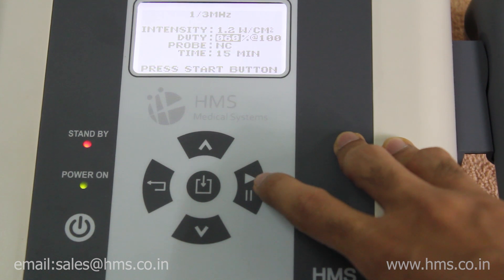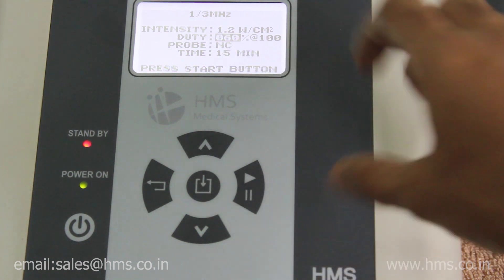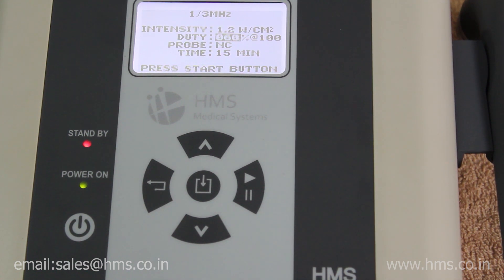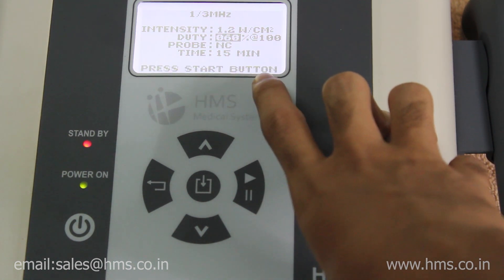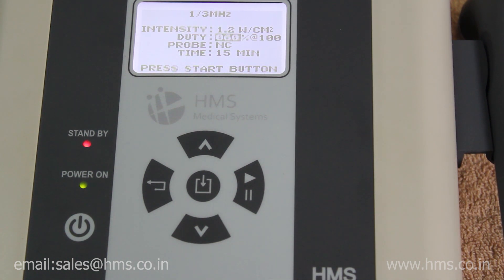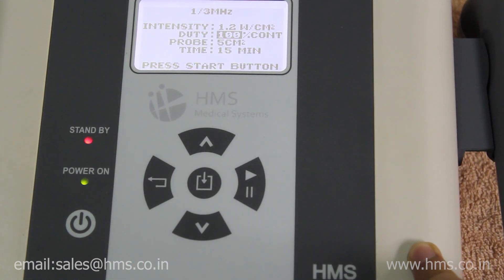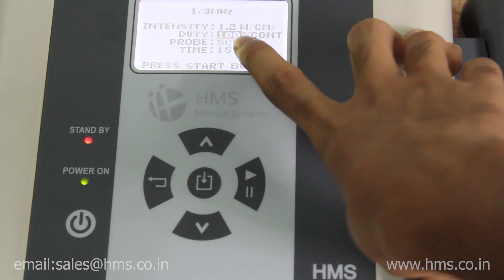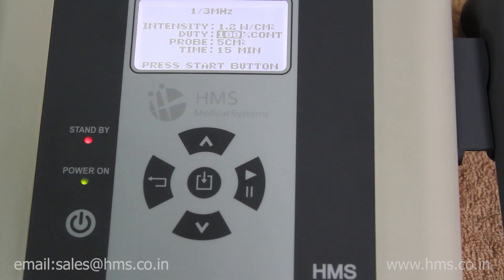When you press start, the probe selection shows 'NC', meaning the transducer is not connected. Without the probe connected, you can't start the machine — it will show the error 'connect the probe.' After connecting the transducer, the machine detects the type connected and shows '5 cm²'. The 5 cm² transducer comes by default; a 1 cm² transducer is available as an optional kit.